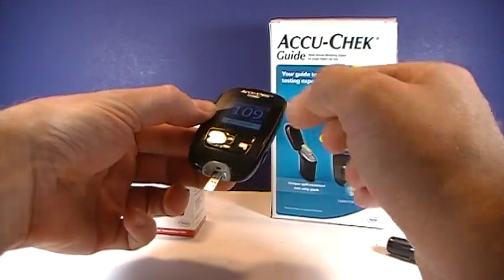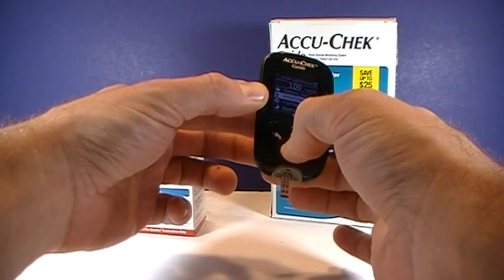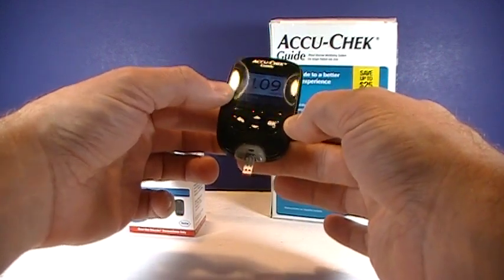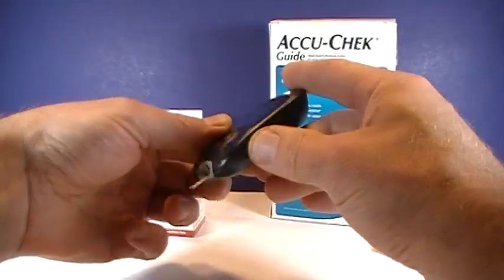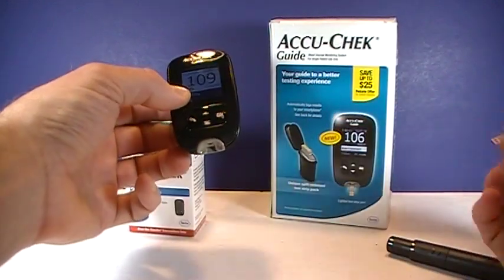You can add a comment if you'd like. I'll just call it 'fasting,' even though I had a little bit to eat a little bit ago. To remove the test strip, you just push this button on the side, and now that test strip can be disposed of.